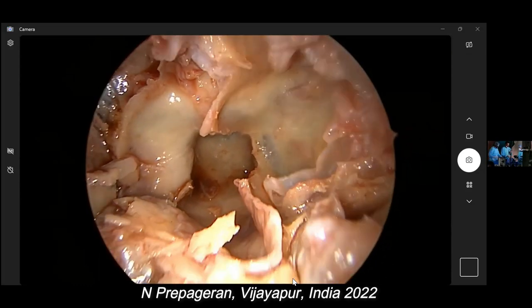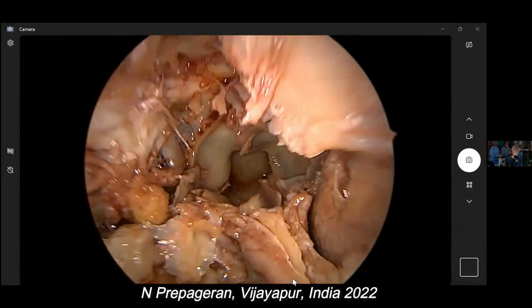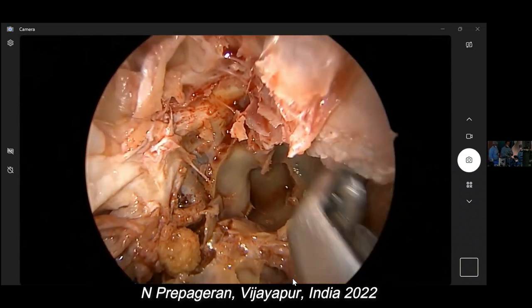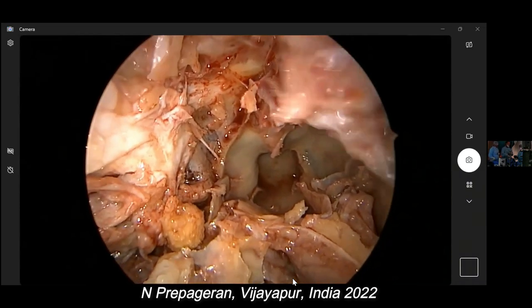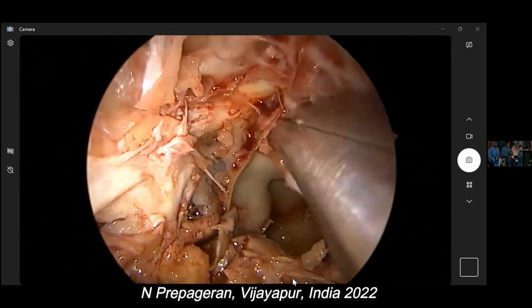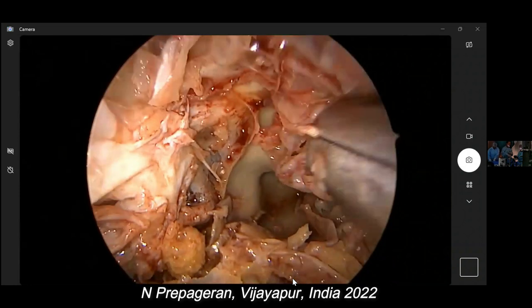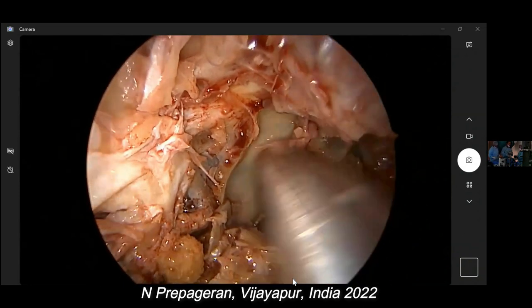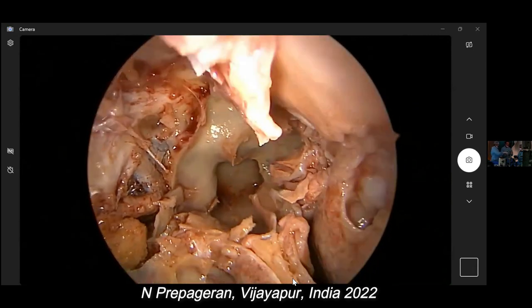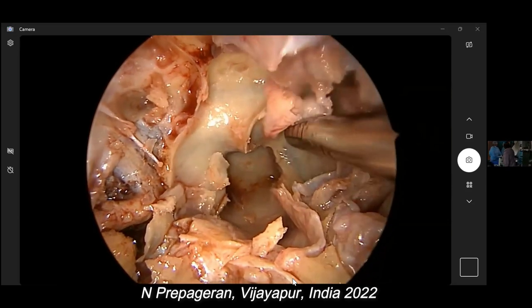What will I do? This is what I would do. You understand what I'm trying to say, right? Optic nerve is that. Sorry, before that, let me open up the entire sphenoid first. There. Divider again. There you go, guys. Better. Now we are in the sella.